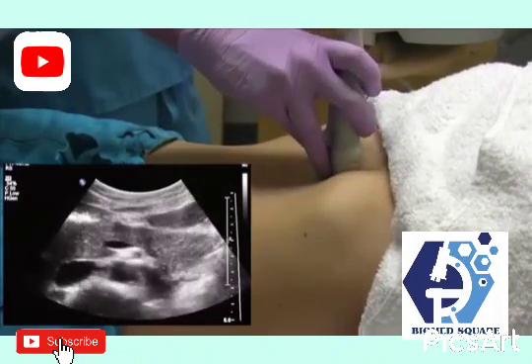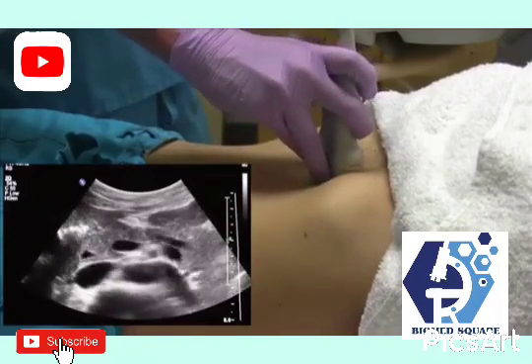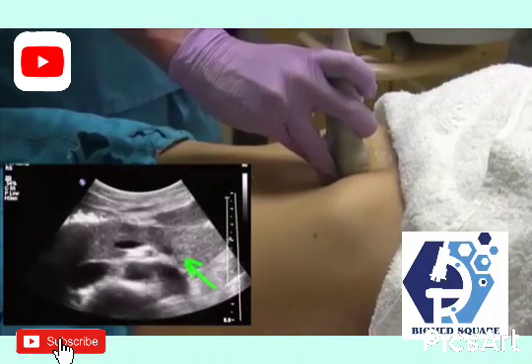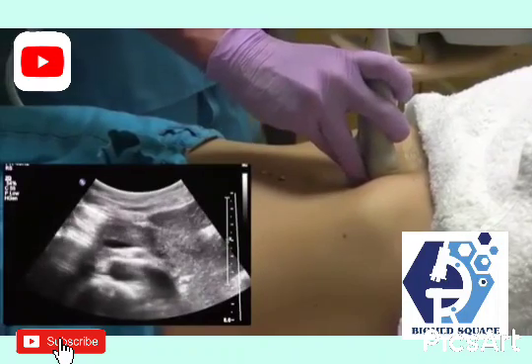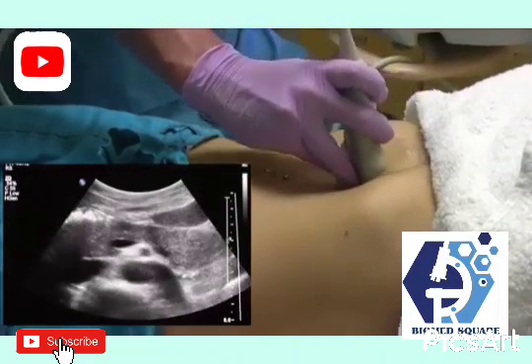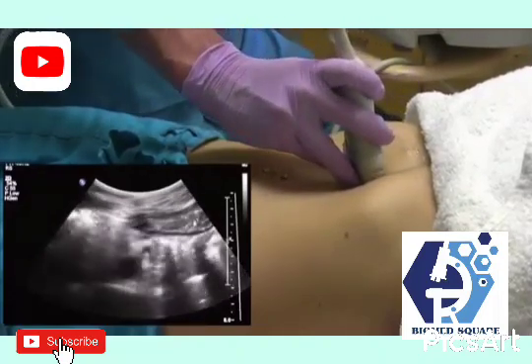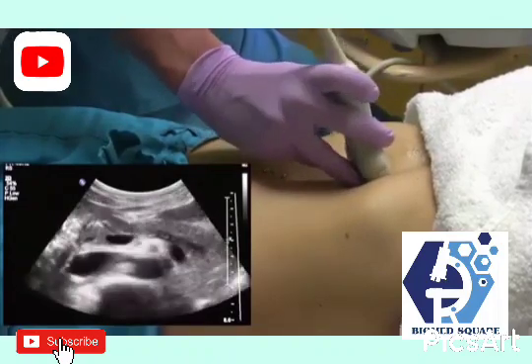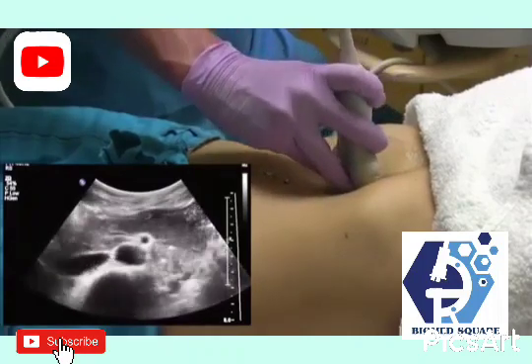And if you look on this image here, you want to see that splenic vein is a good landmark to let you know that you are very close to, if not exactly on, your pancreas. And like every organ, you need to sweep through. If you just see the splenic vein and you take pictures here, you can miss other pathology in the pancreas.